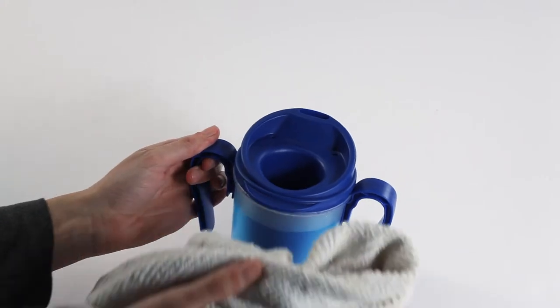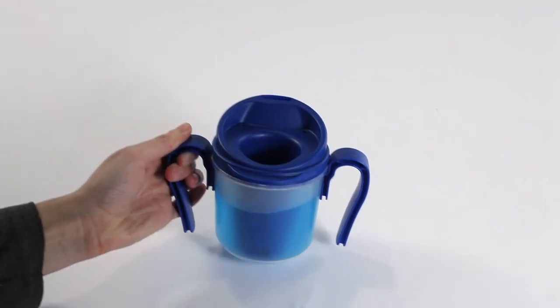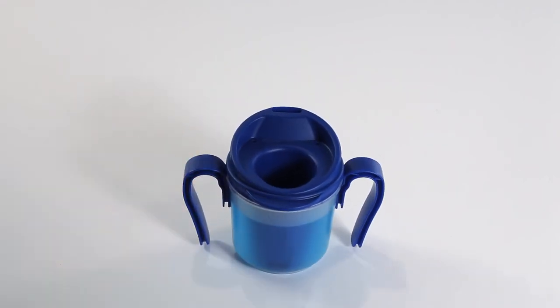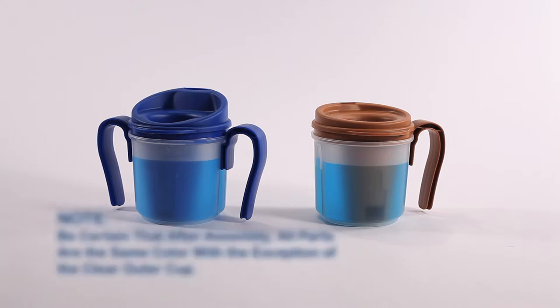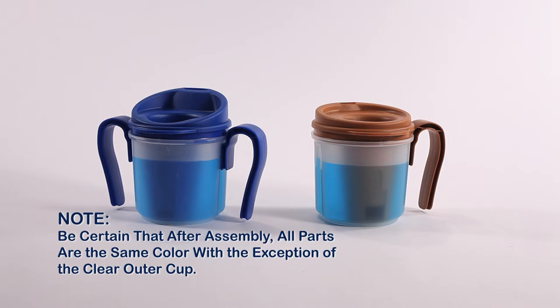Make sure no liquid has splashed on the outside of the cup. If so, wipe the cup dry with a clean cloth. Inspect the cup for proper assembly. Be certain that after assembly all parts are the same color, with the exception of the clear outer cup.